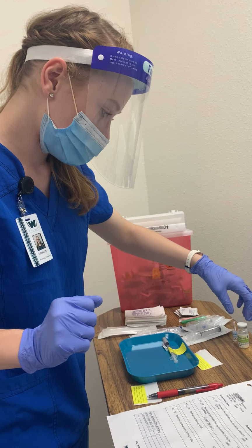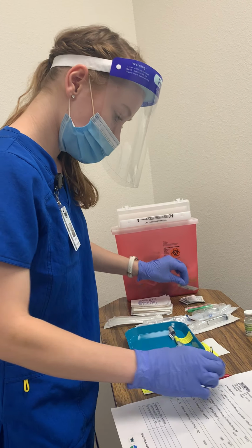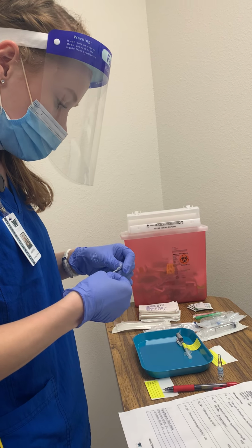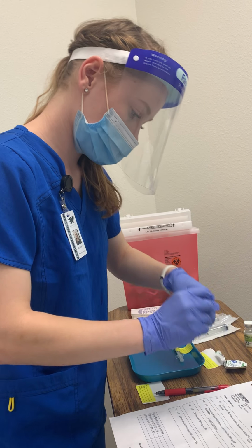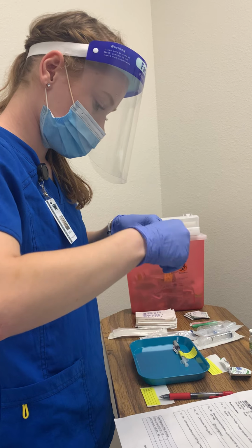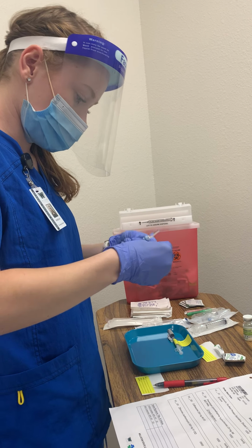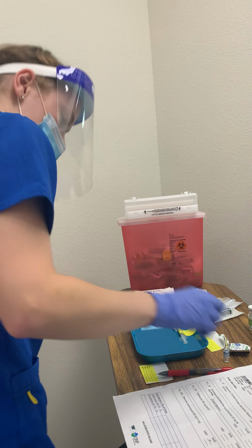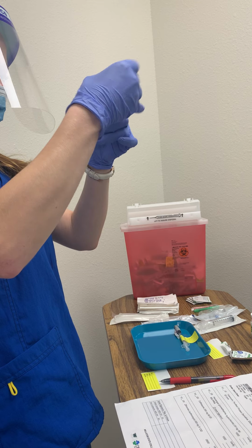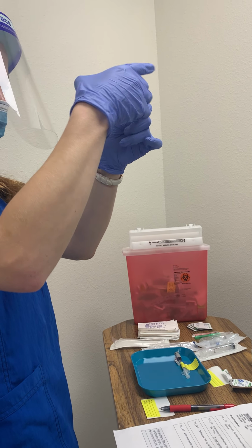And then I'm going to be moving on to my Phenergan. For this Phenergan, it's in an ampule, so I'll need to clean this. Make sure it's all good, there are no cracks in the bottle. And then I'll make sure all the liquid is from the top, so I get exactly 1 mL.